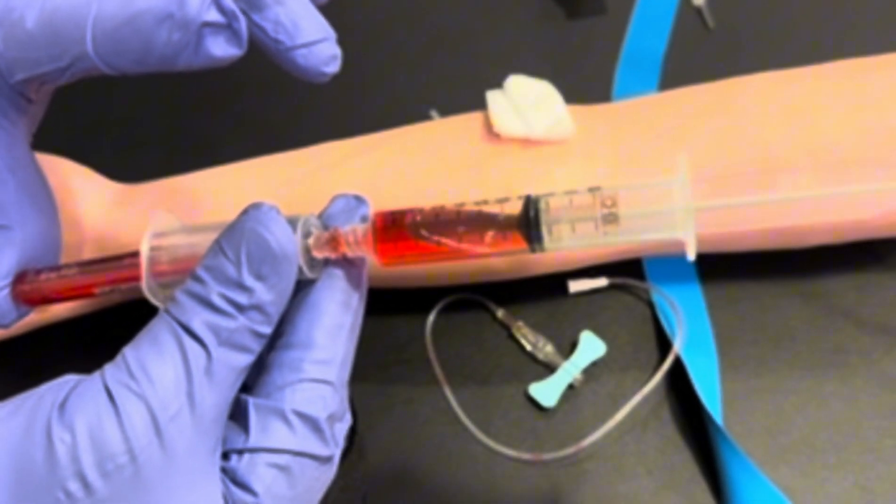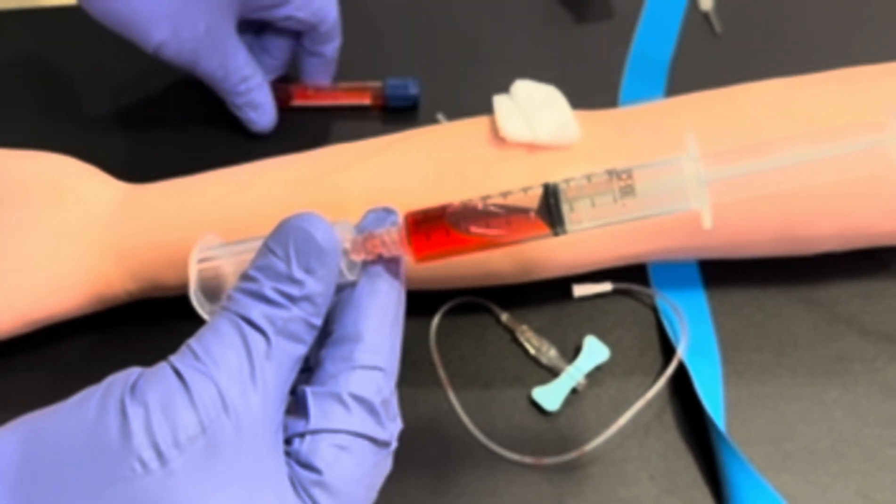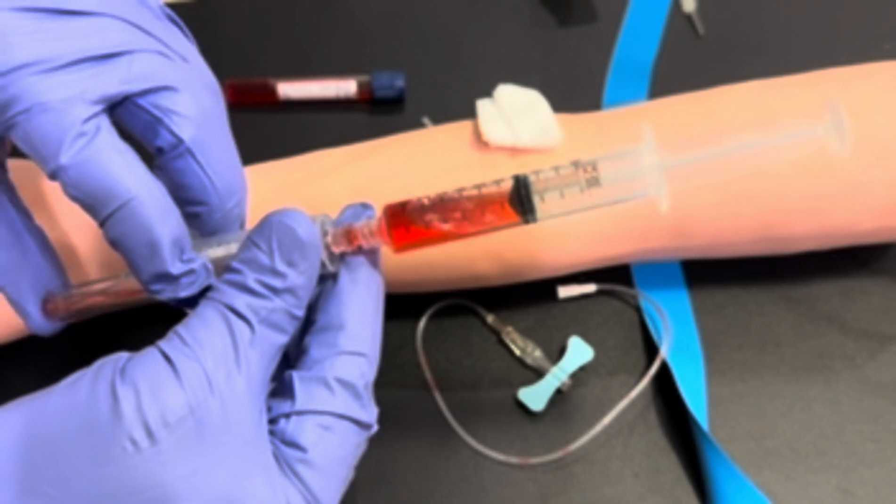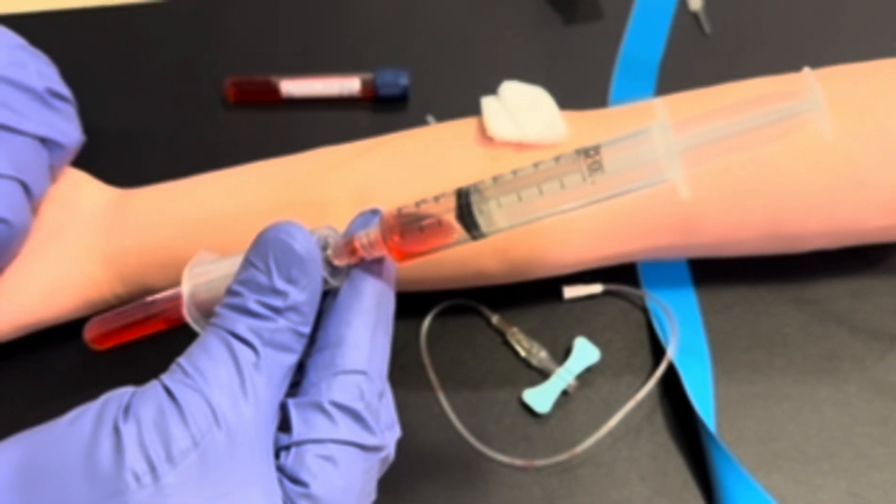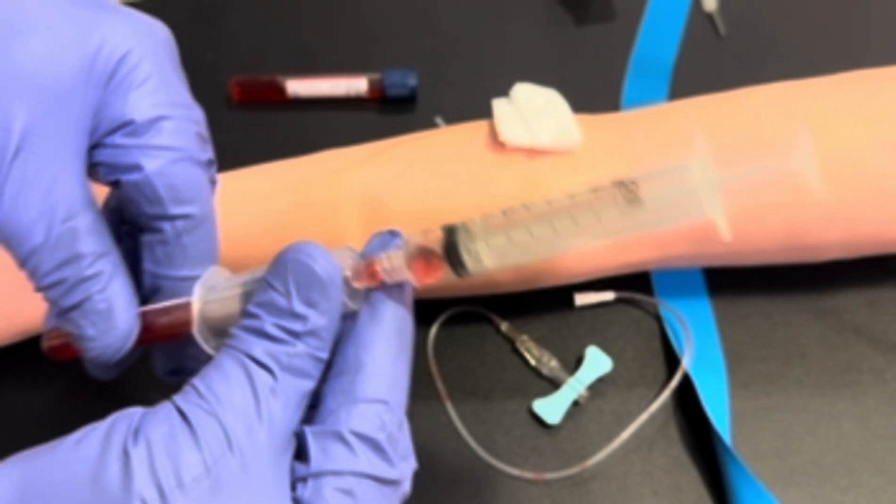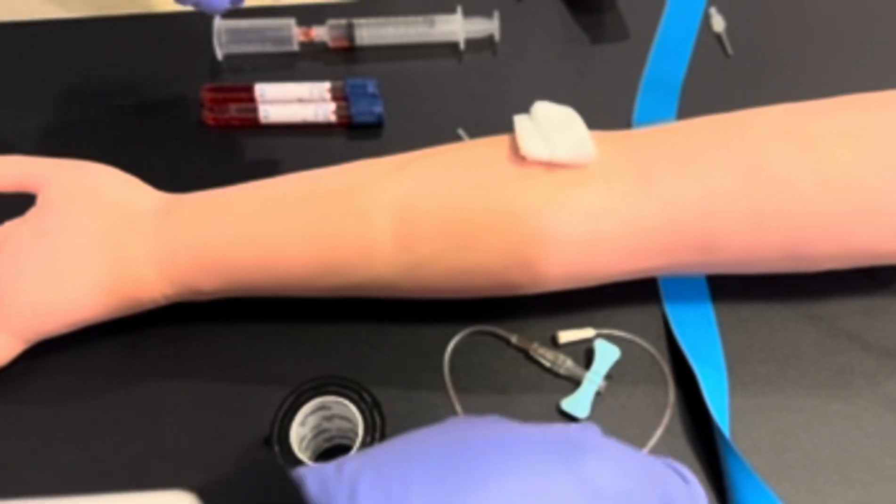Allow each tube to fill. With this collection, you can perform multiple tube collections, being that we used a 10cc syringe, so we could actually fill two complete vacutainer tubes.